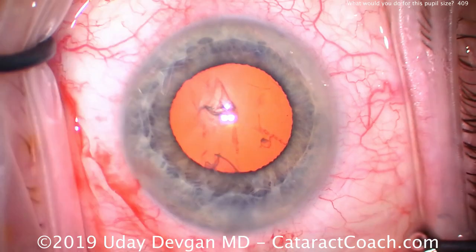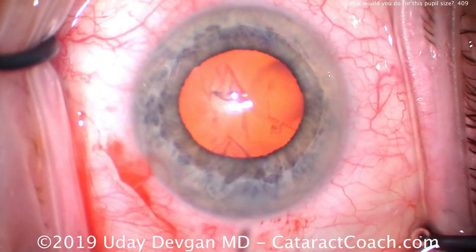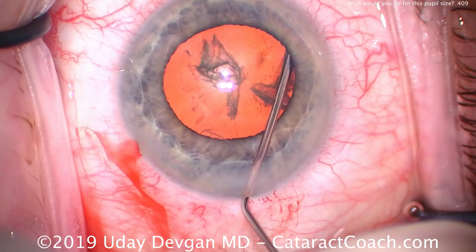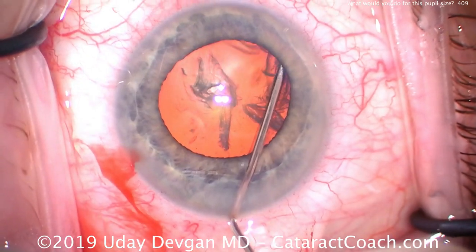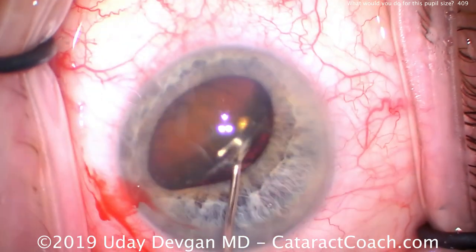You can certainly do this technique — it's not difficult to learn. Just make it under the iris; have faith you know where it is. Now we anticipate the pupil is going to come down during surgery, so let's get the nucleus out of the capsule bag with some gentle hydrodissection. There it is, and now let's make sure it stays above that pupil edge.